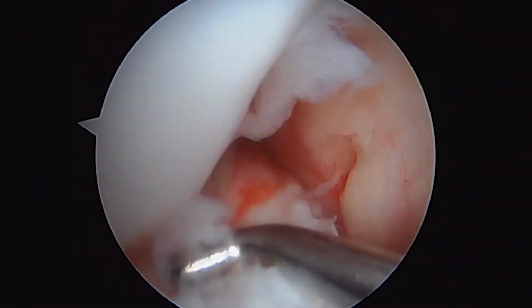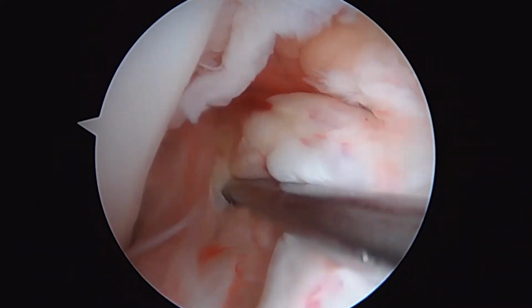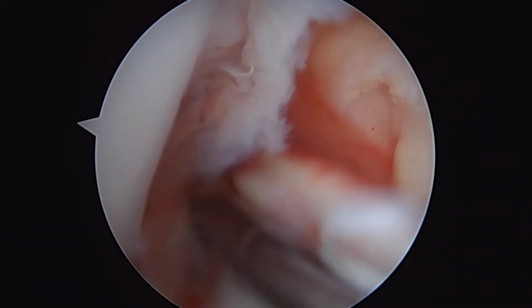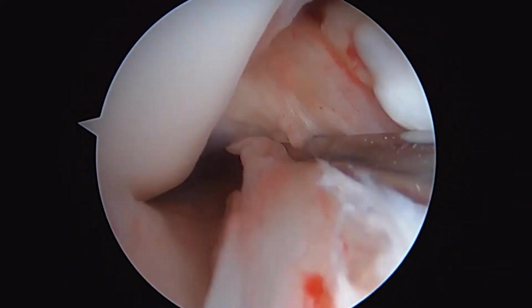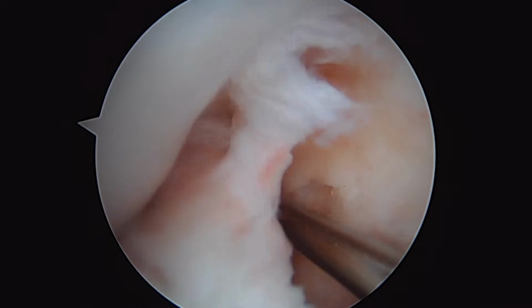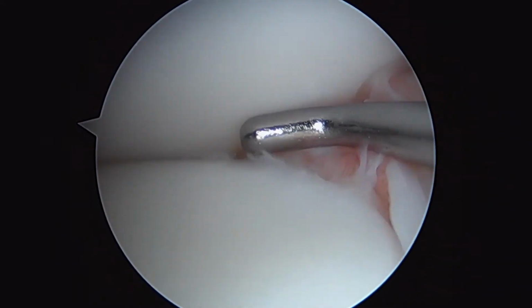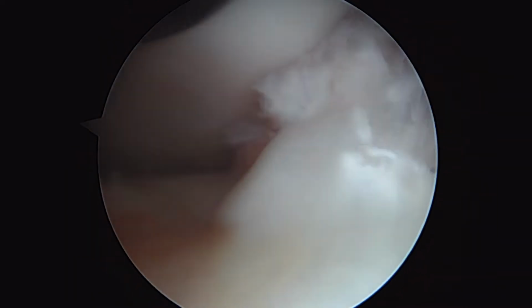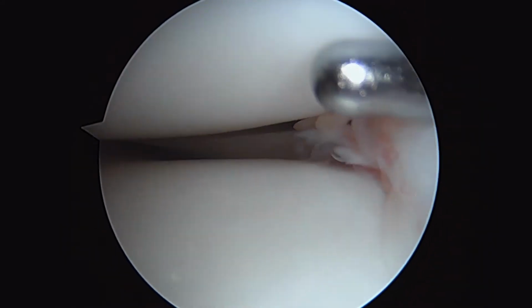Here it is here. This is what the torn ACL looks like. You can see how we can see all the way through the back of the knee there, which isn't really normal in someone your age. So we'll deal with that in a little bit. Before we do, hold that please, I want to look in the lateral compartment and in the patellofemoral compartment. Push down gently on the knee, please.